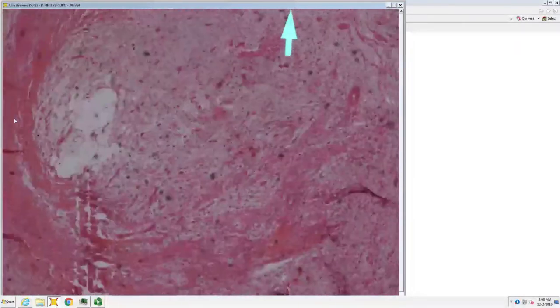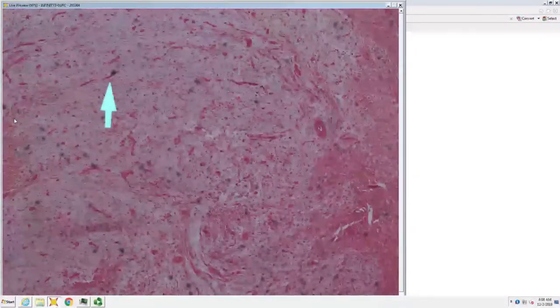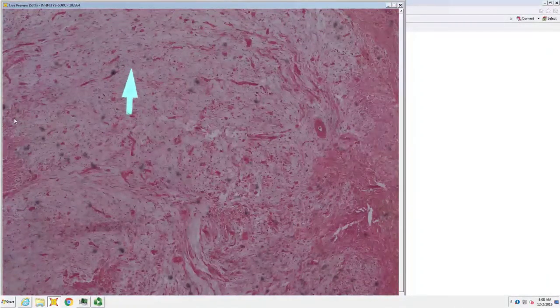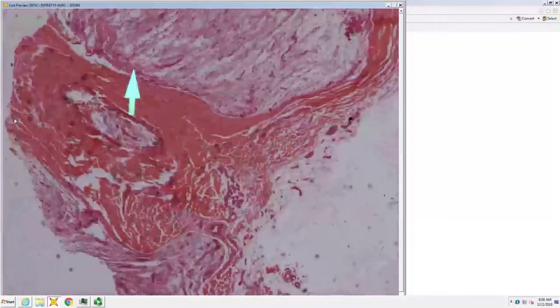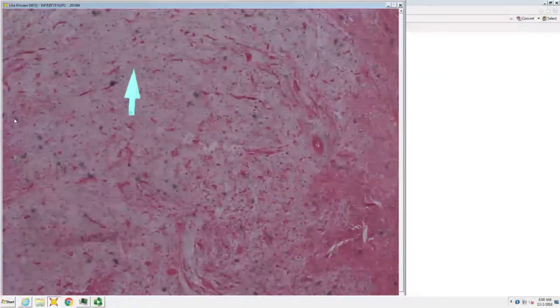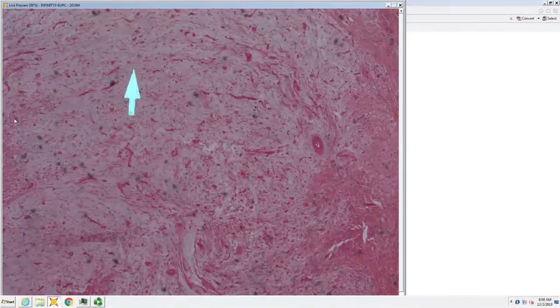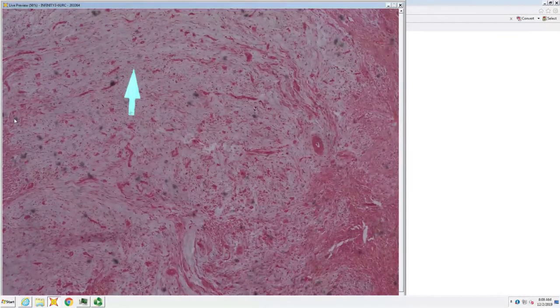So it's all myxoid tissue and fine ropey collagen. If there's fat, lipocytes, you'd think of a spindle cell lipoma. And if there's no fat at all, it still could be a so-called non-fat spindle cell lipoma. It could also just be a myxoma. If there are multiple of these in the patient, and they've also had cardiac myxoma and blue nevi, then they've got Carney's complex.